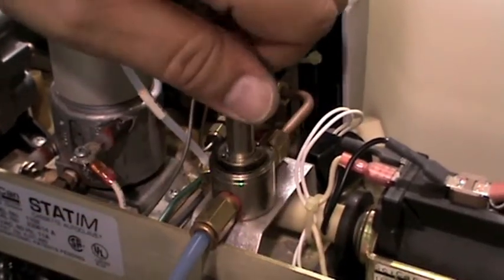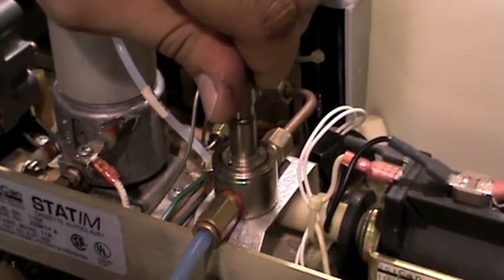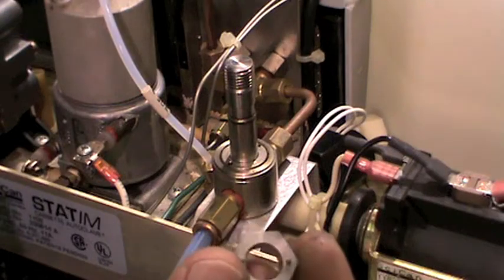Take care not to over-tighten the valve stem when reinstalling. The stem should be snug and secure — about an eighth to a quarter turn with a wrench after finger tightening should be enough.